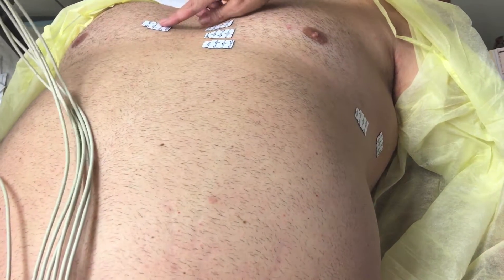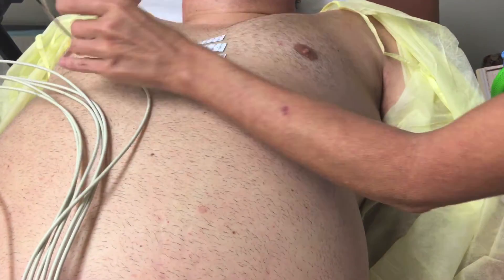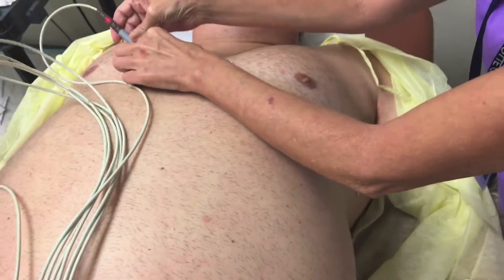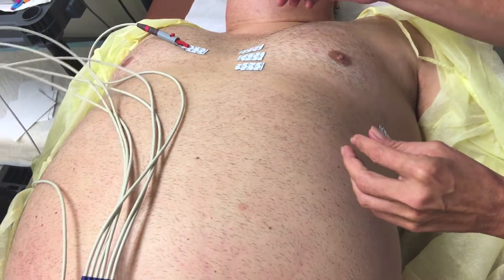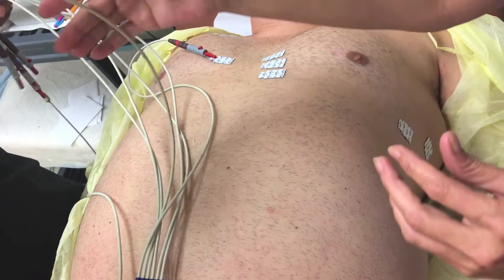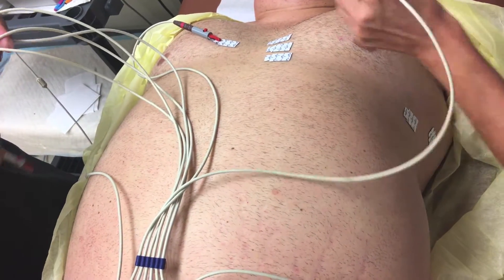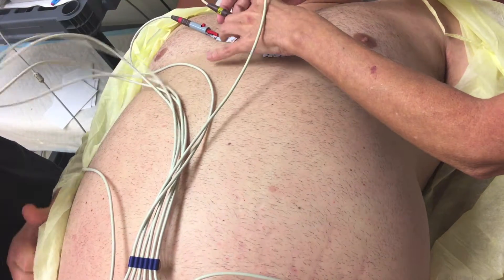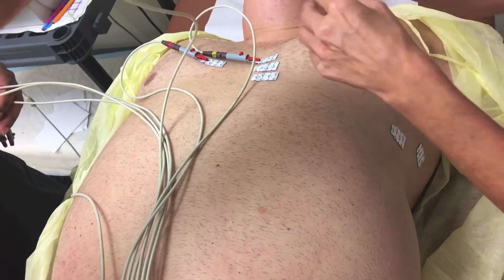We need to start with V1 — which is this one. Then this one is V2. We want to try to keep the lines from tangling as much as possible. Are you doing okay there, Ms. Matthews? Almost ready. That's V3.